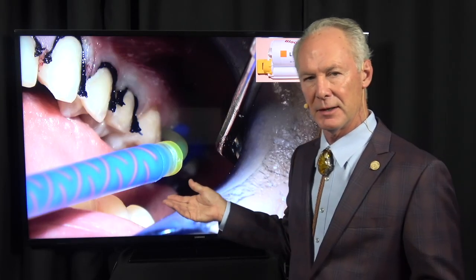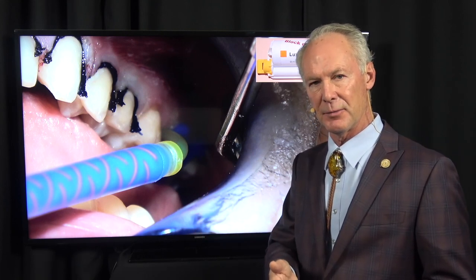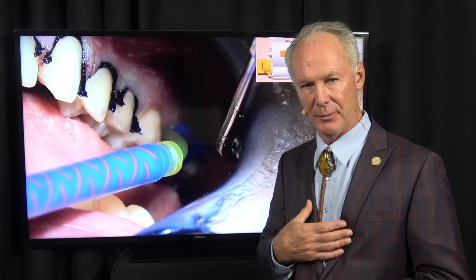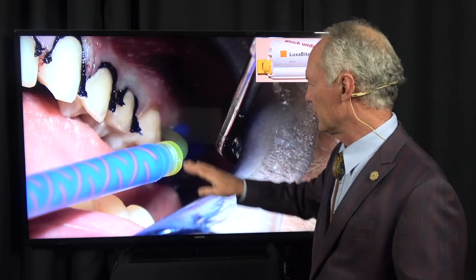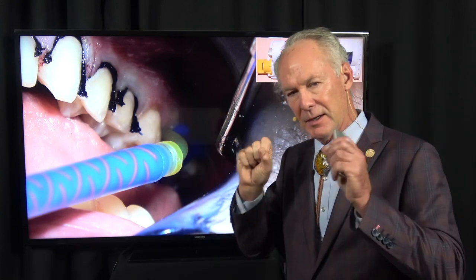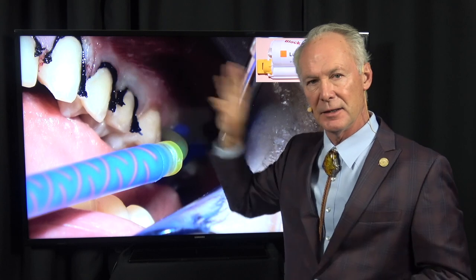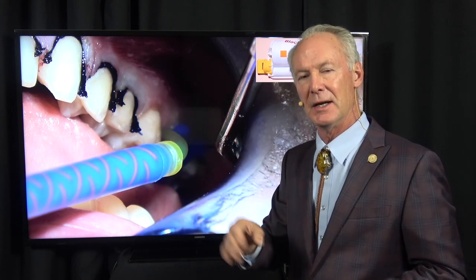Now, some of you may use scanners. I still like polyether with custom tray, and then I chase that with a reversible hydrocolloid impression because I feel like it's easier for me in my hands to capture subgingival margins with polyether with custom tray, because that custom tray, as I said, forces that material when you remove this cord down into those sulcus and captures those margins. It's a little trickier with a scanner to capture subgingival margins. You have to blow air, and you know, it's not that it can't be done. It's just I've done it this way so long and it works.